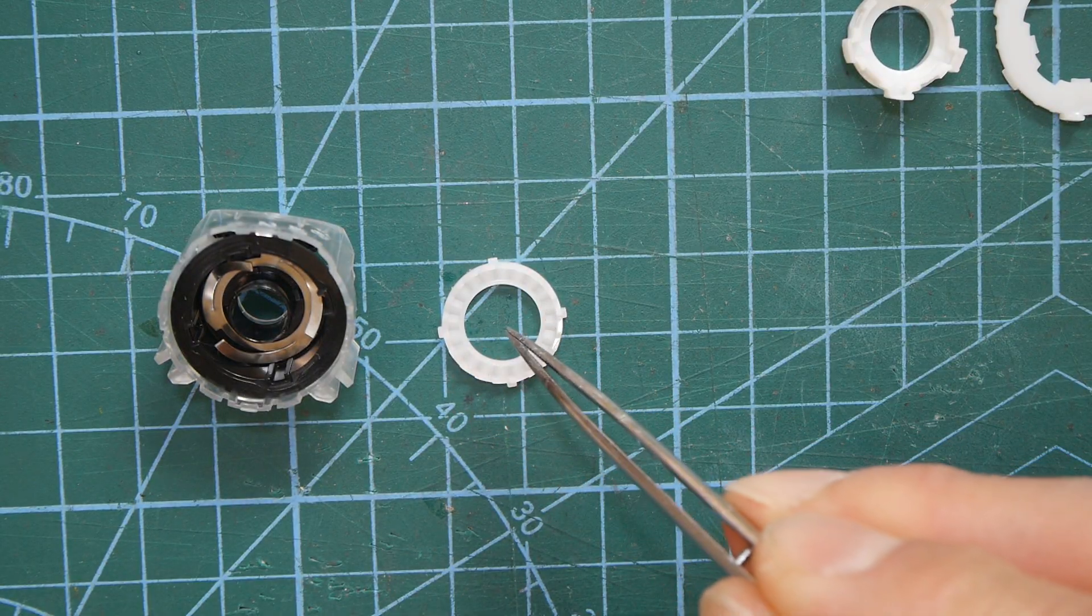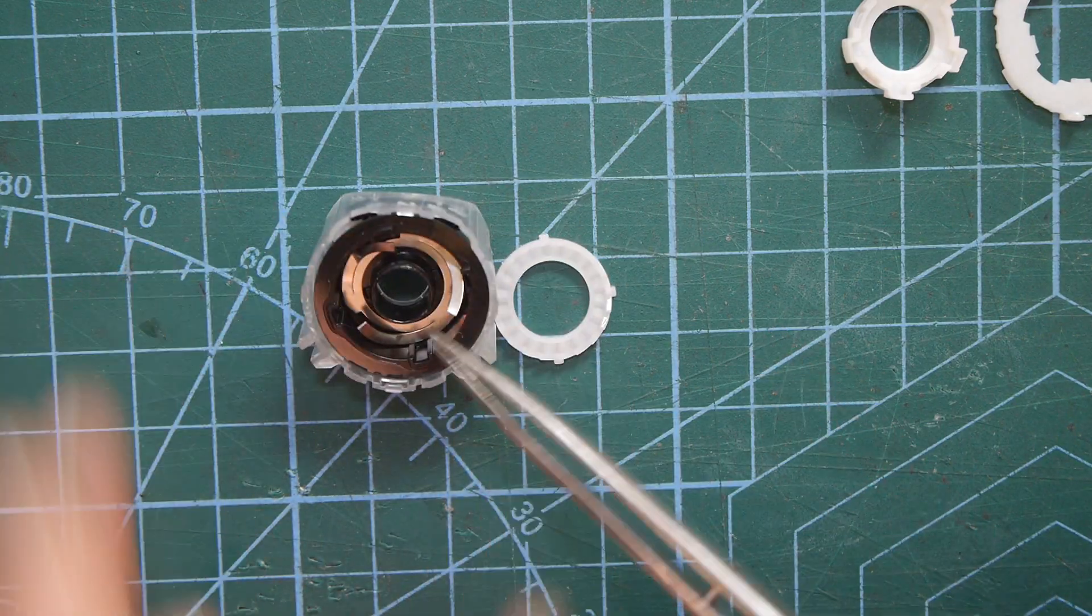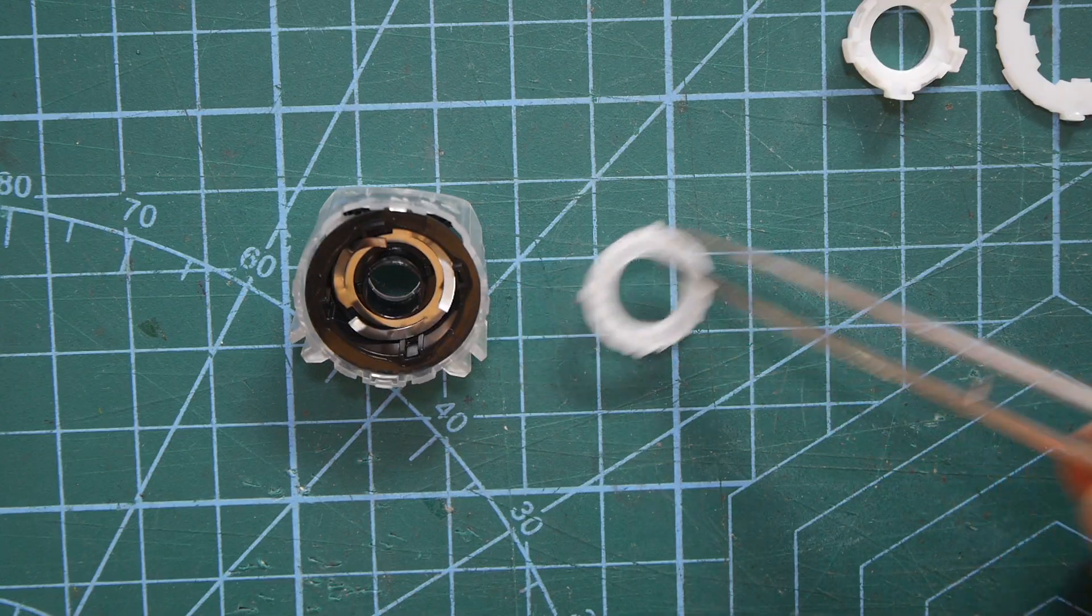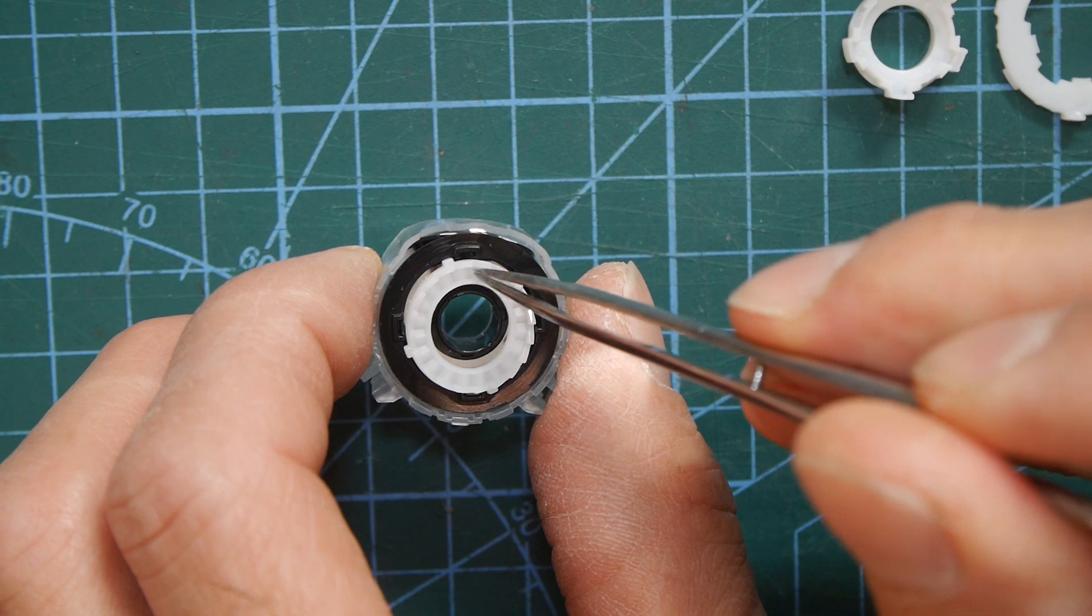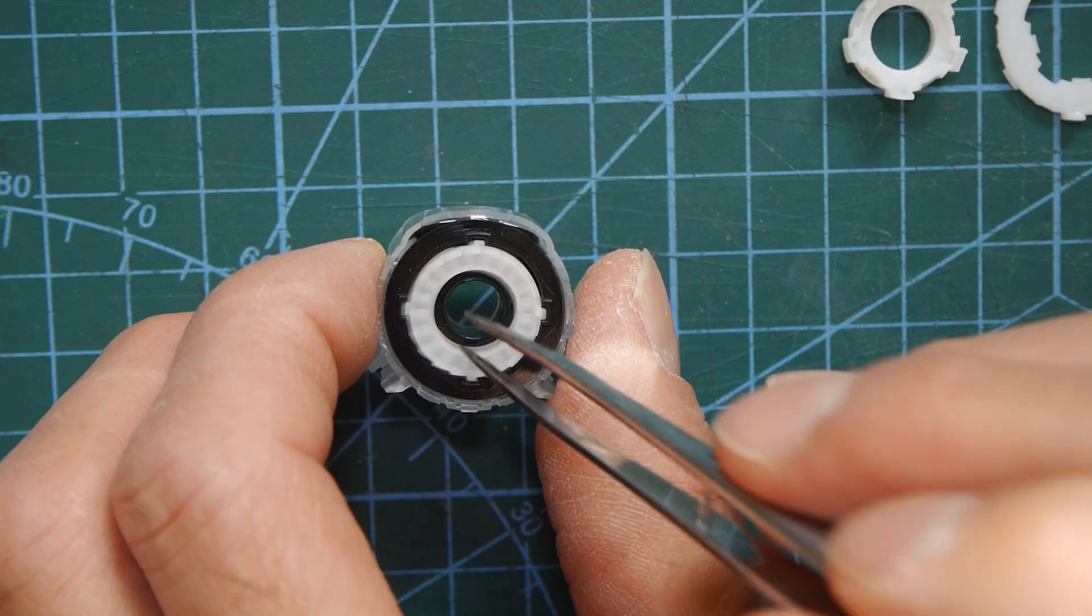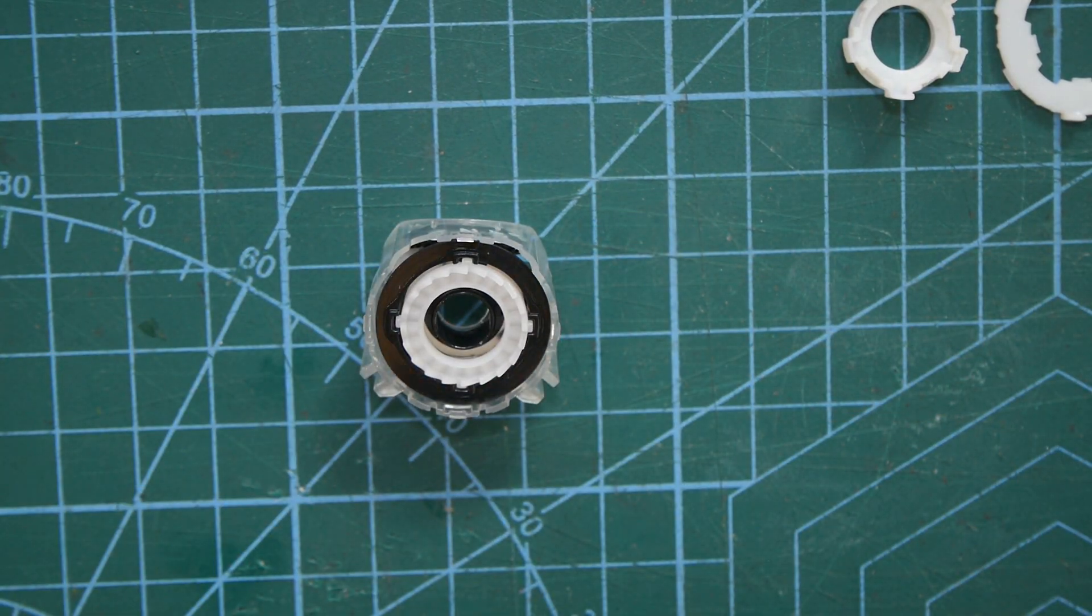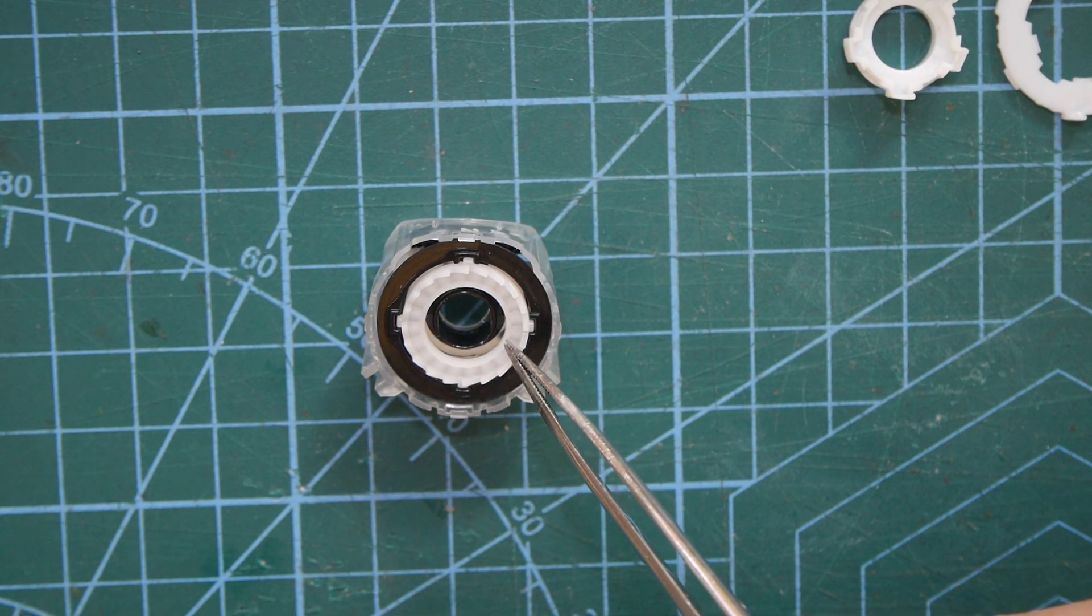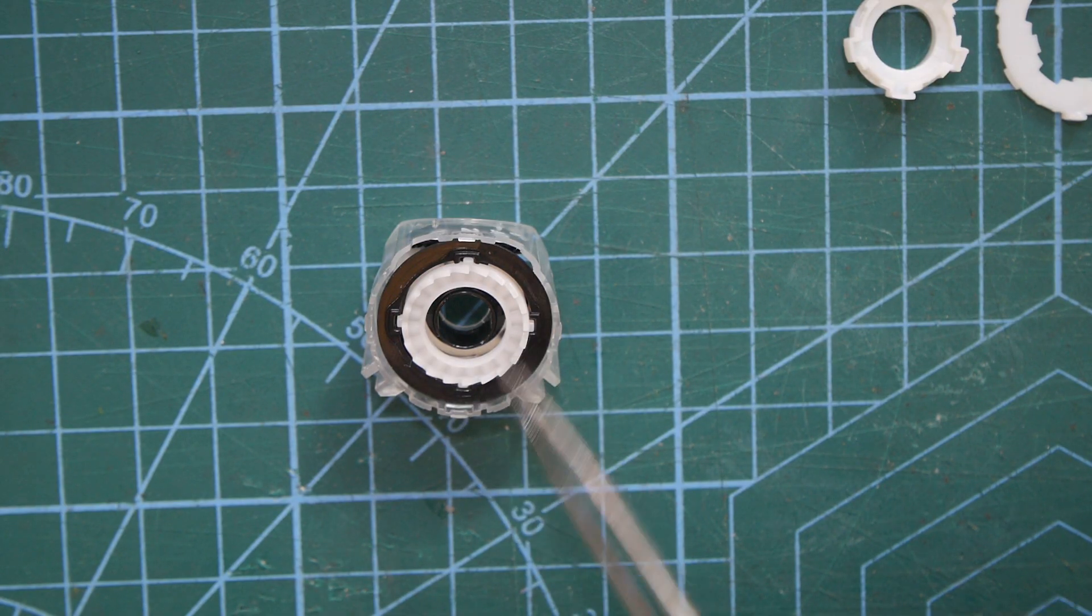And then the next bit that goes on top of that has little sort of ratchety gears on it. Now you might think okay so that goes down there and turns the spring, nope, the spring is literally just a spring. So the ratcheted gears have to actually go in from above.